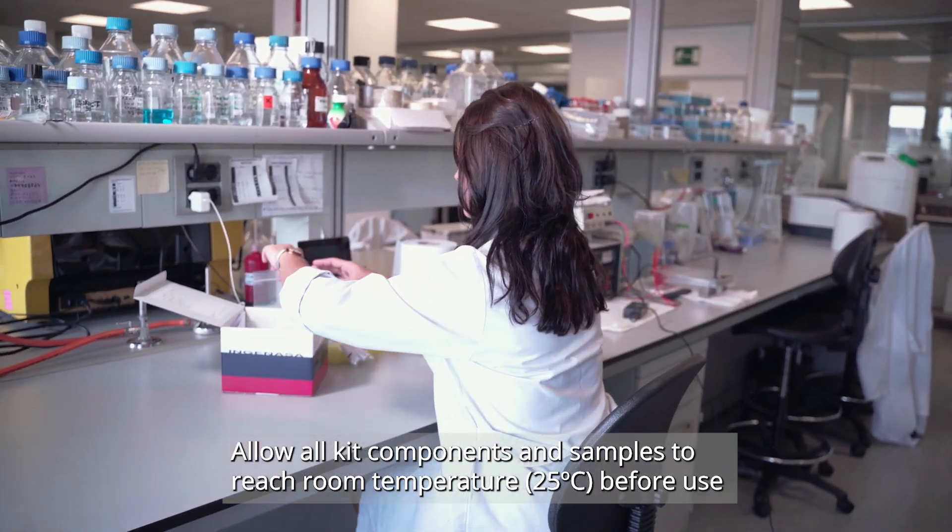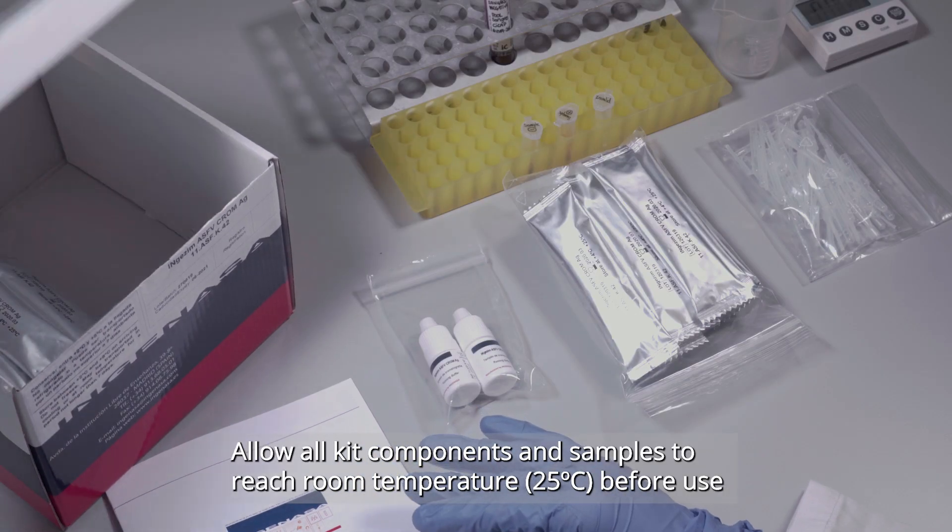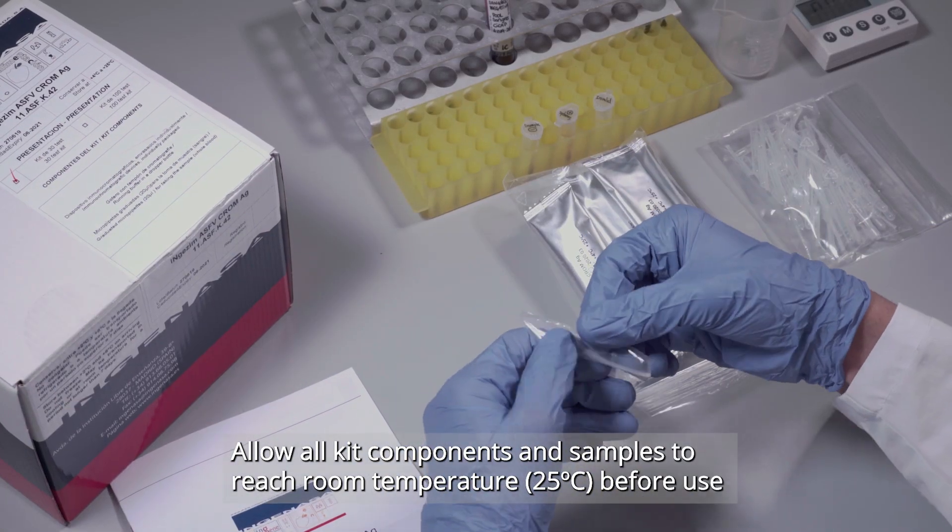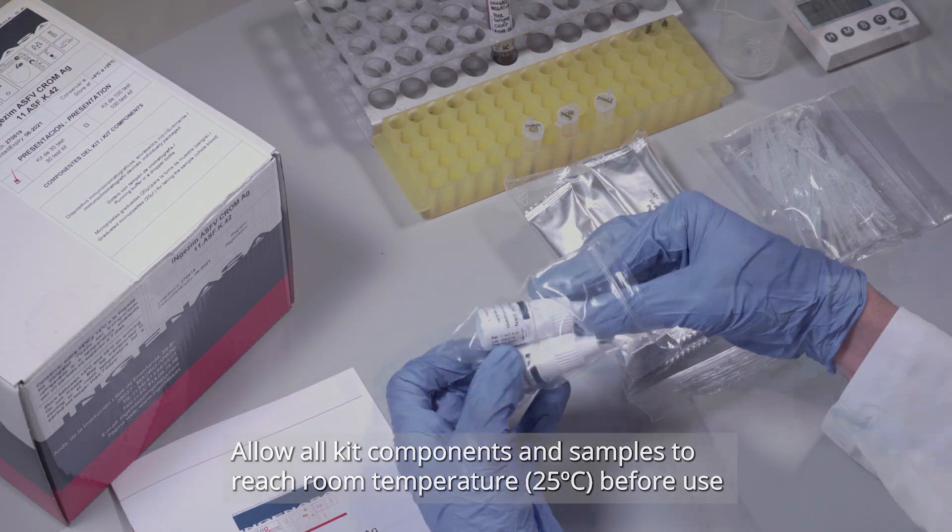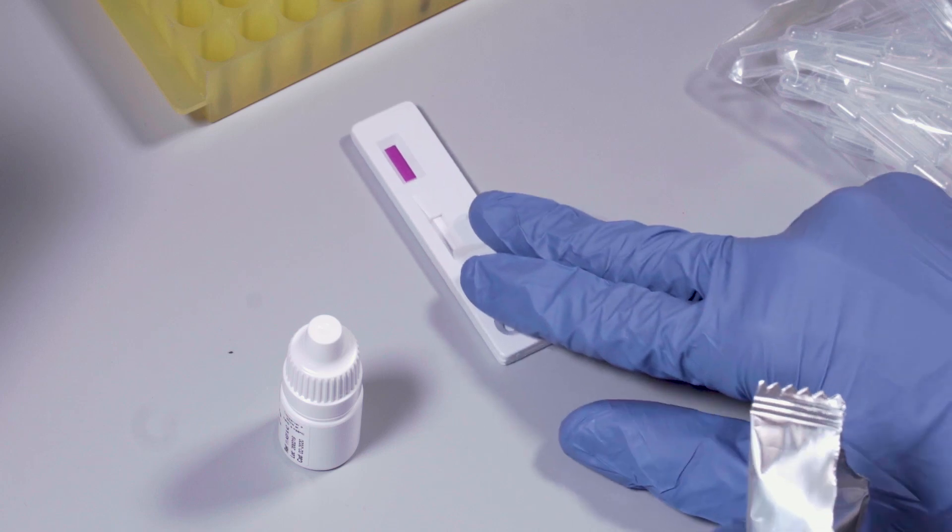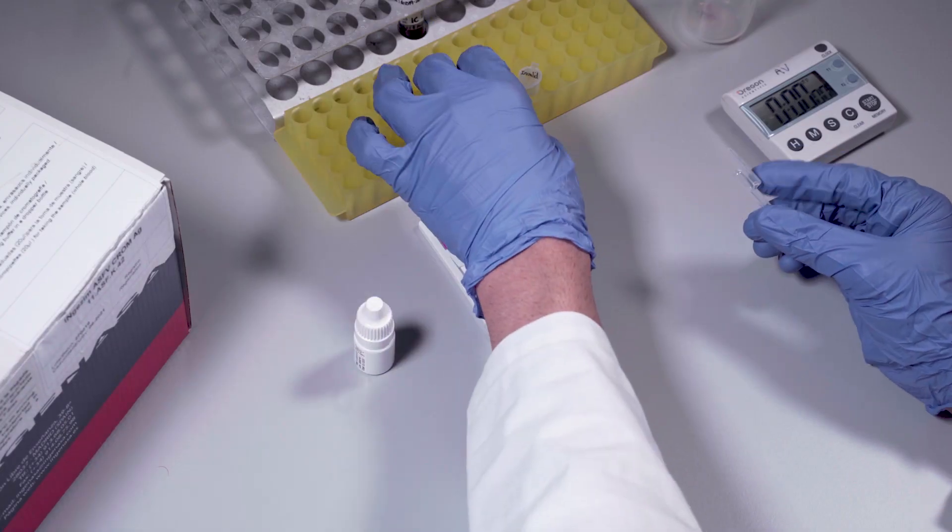Take the components from the box and allow them and the samples to reach room temperature. Remove the device from the aluminum pouch and discard the desiccant. Place the device on a flat surface.